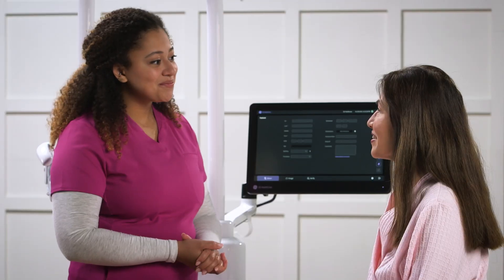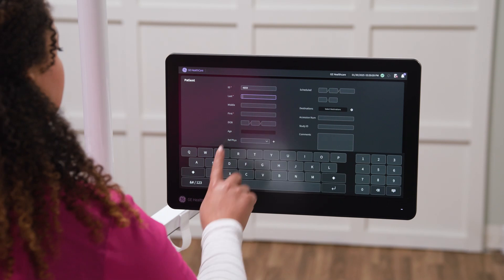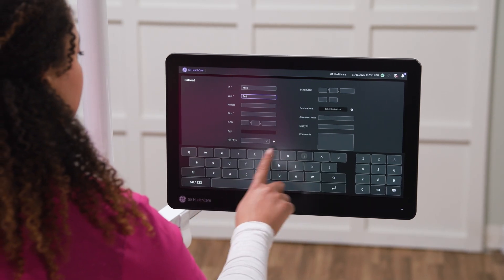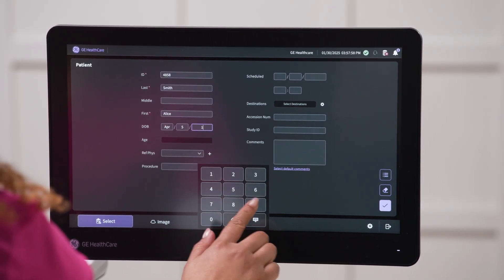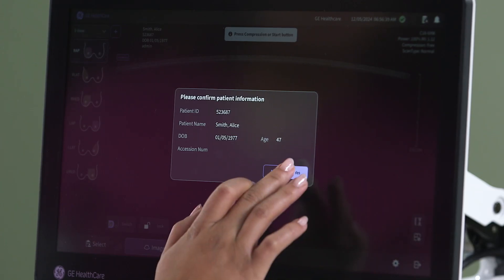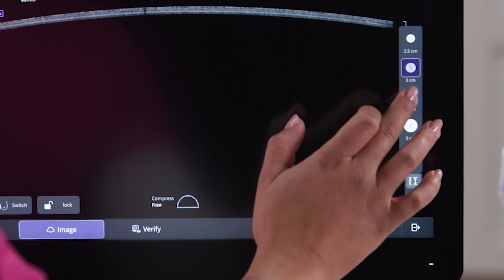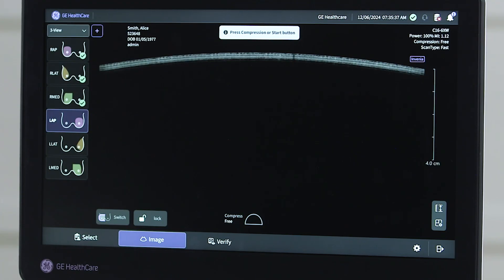The exam begins by selecting the patient information from a work list or entering it manually. The intuitive user interface enables quick parameter setup, customized to individual body habitus. Gain and focus are automatically set, creating operator independence and reproducibility.